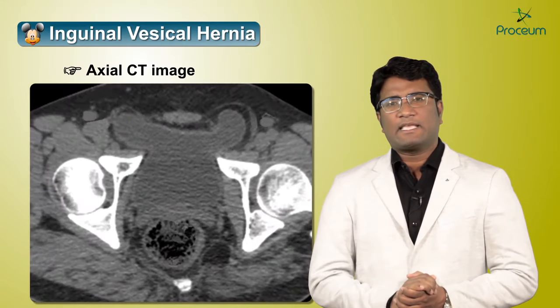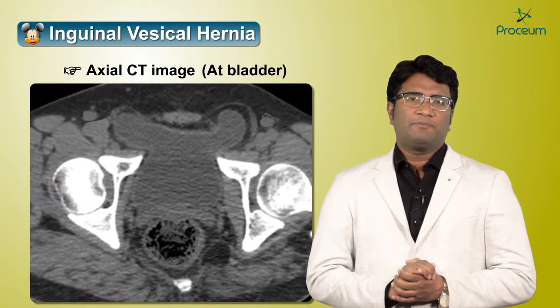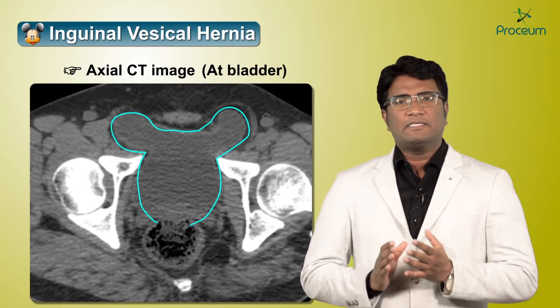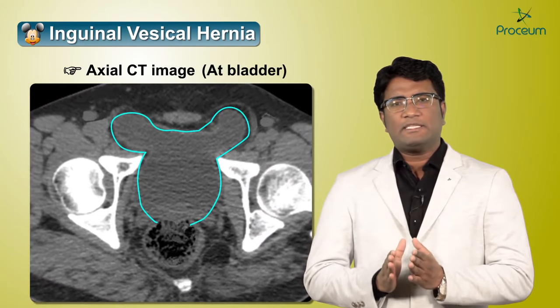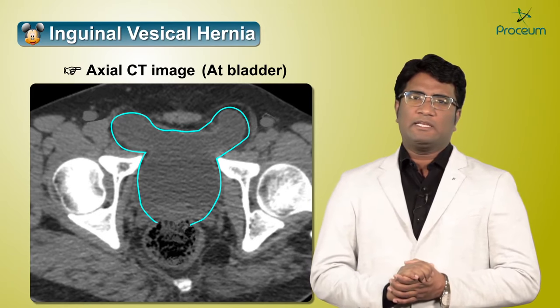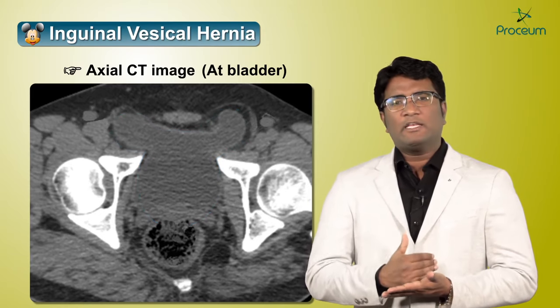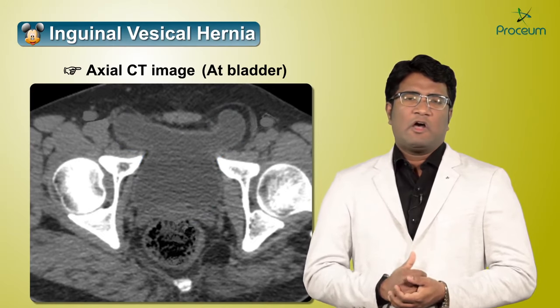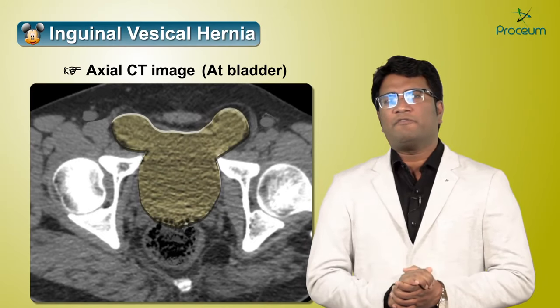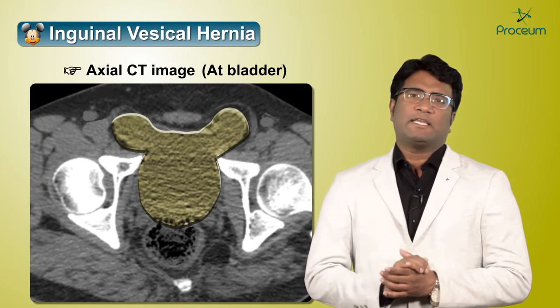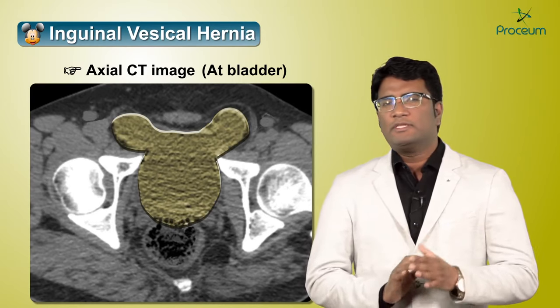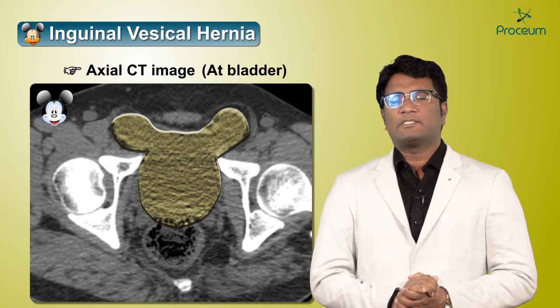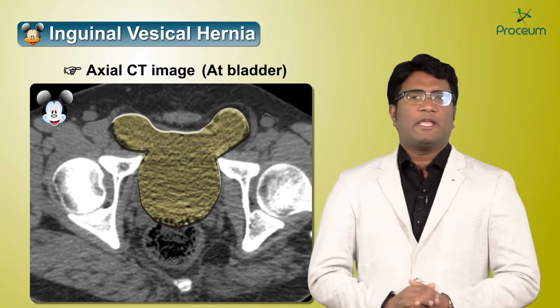Another site where we can see a Mickey Mouse appearance is on axial imaging at the level of the pelvis or bladder. On a CT scan at the level of the bladder, when the bladder is distended and shows herniation into the inguinal regions, this inguinal vesical hernia on axial imaging takes the shape of a Mickey Mouse. So, this is all the places where we see the Mickey Mouse sign in radiological imaging.